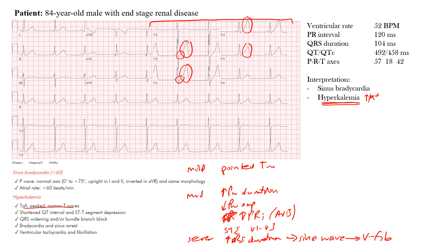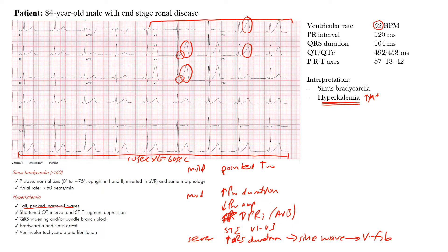Now let's look at the EKG. The rate given is 52 beats per minute. We can verify this: from beginning to end of our EKG represents 10 seconds, times 6 equals 60 seconds. Counting the complexes across gives us 9, and 9 times 6 gives a rate of about 54 beats per minute — close to the given value. The PR interval here is 120 milliseconds.